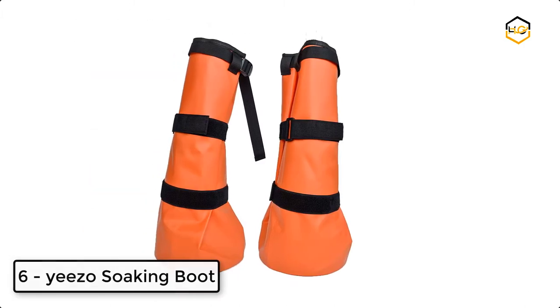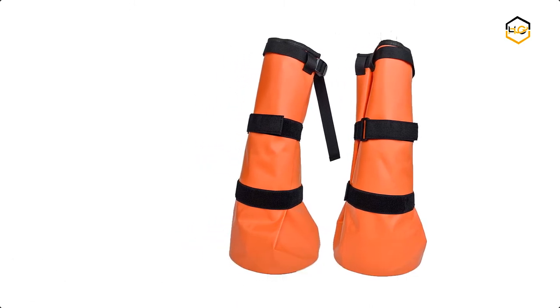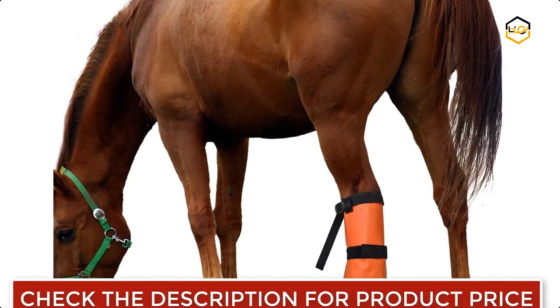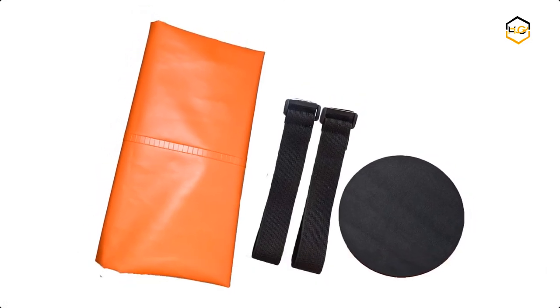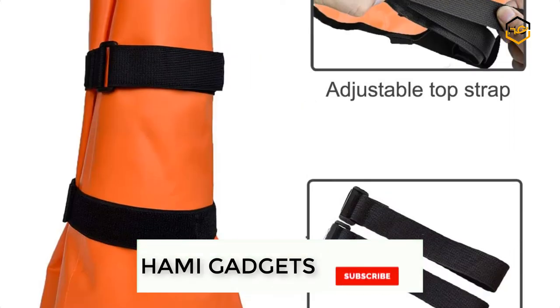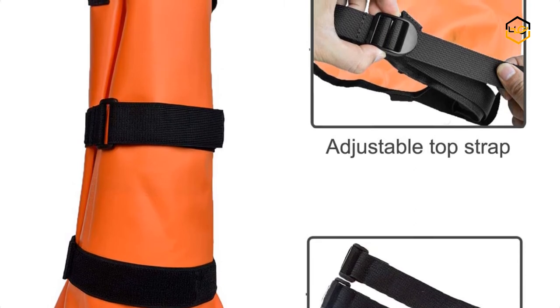At number 6, we have the Yeezo Soaking Boot. The Hoof Soaker Bag is ideal for common hoof ailments treatment. It fits all hooves from draft to donkey and suits hoof sizes up to 8 inches in diameter. This durable, reusable, heavy duty plastic soaking bag can be used for hoof soaking, and is suited for puncture wounds, deep dry hoof conditioning treatment for thrush or bacterial infections.